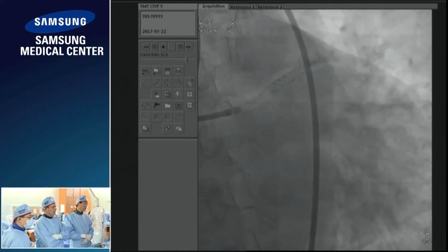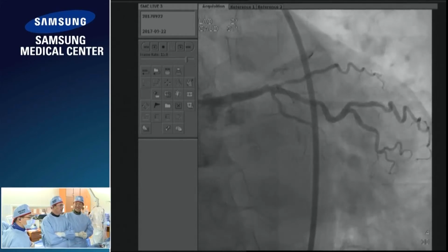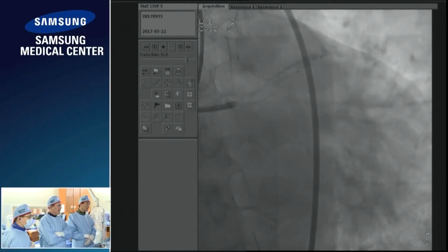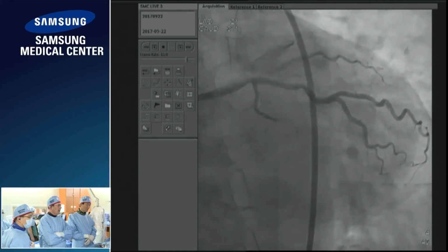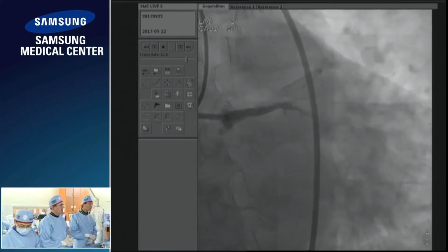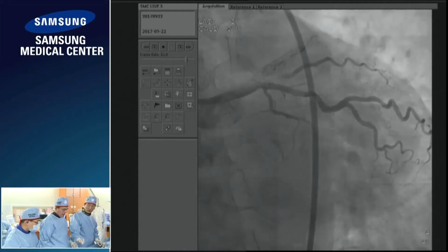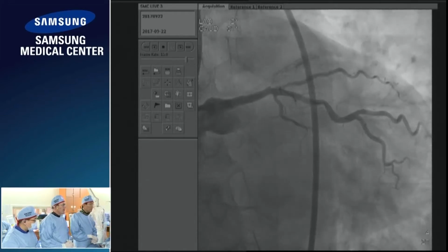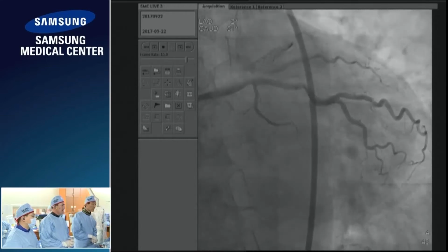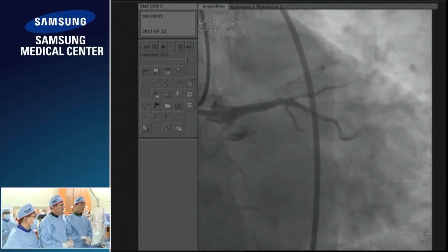the issue is how to treat the left main bifurcation with a lot of plaque burden. You can see it's really a very bulky plaque. We can see the outline clearly in this projection here. There is a reasonable length of LAD which hasn't been stented, but really there's quite extensive plaque extending back to the mid segment of the left main. So we've now got faced with the challenge of how to manage this left main and this bifurcation, assuming that the wire goes down.